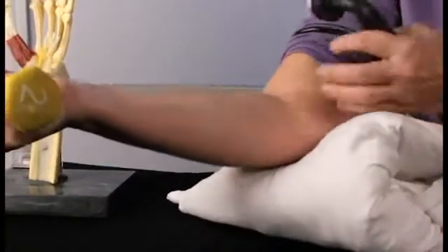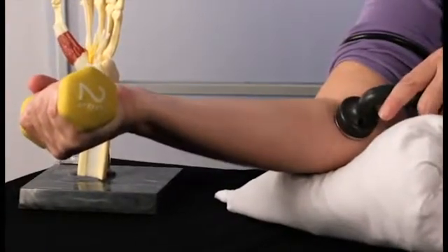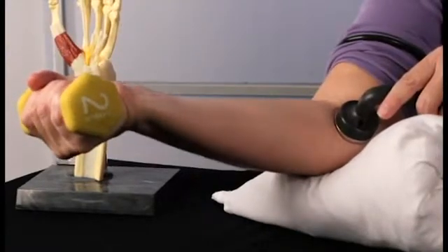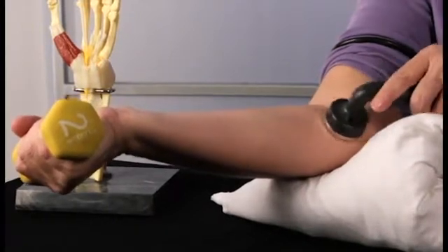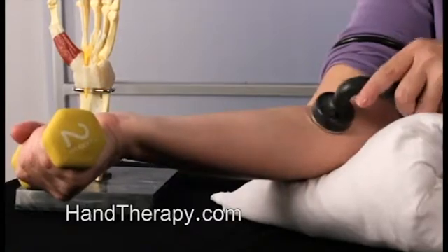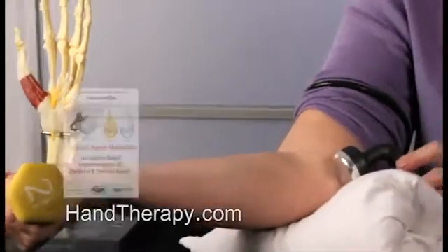The stretch must be maintained during application and immediately following, when you would perform your manual mobilizations. As you can see in this example, I have a stiff elbow. I use continuous ultrasound while the distal part of the extremity has a weight, which creates the stretch in the elbow while I perform the deep heat with the ultrasound.